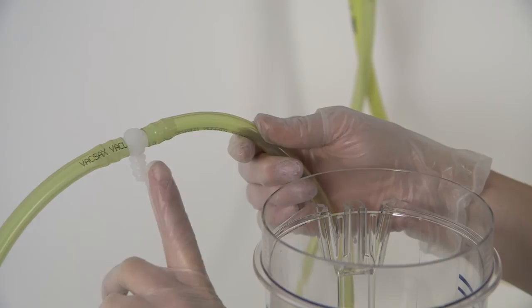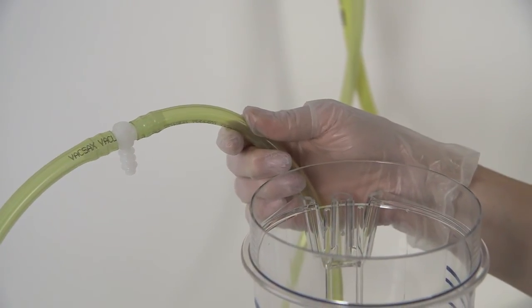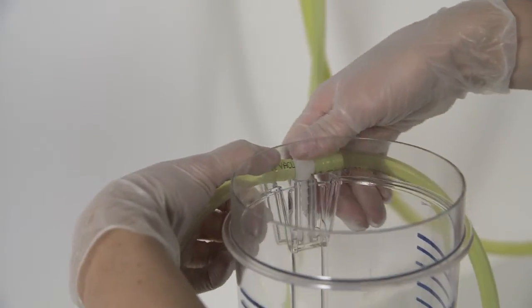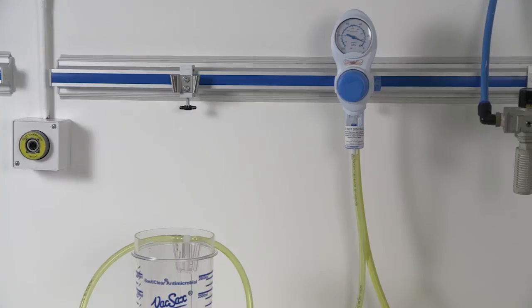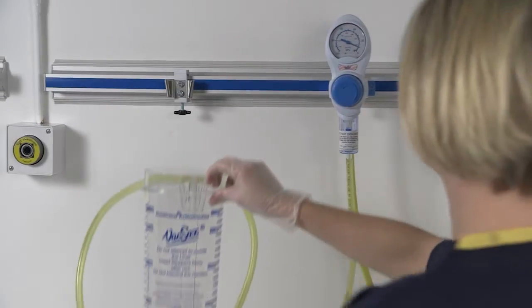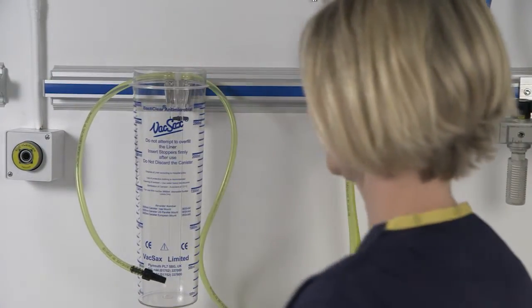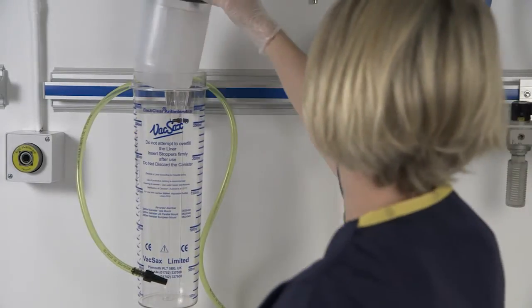Taking the yellow vacuum tubing, insert the vacuum T-piece connector located within the tubing kit itself and press firmly into the port situated at the back of the canister. Start by placing the 3 litre canister into the wall bracket. Place the 3 litre liner into the canister.